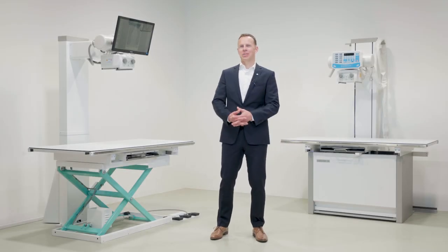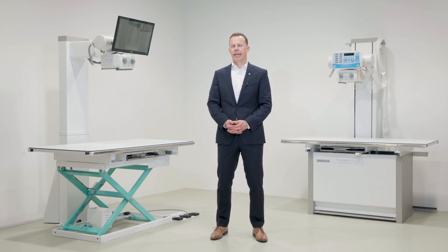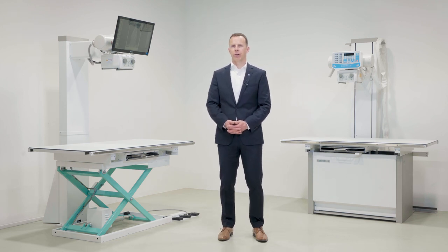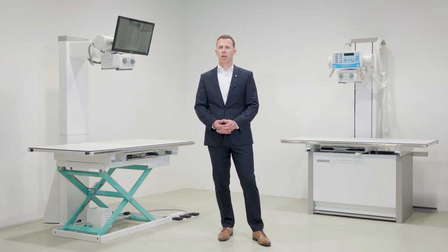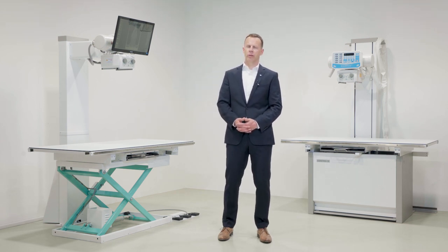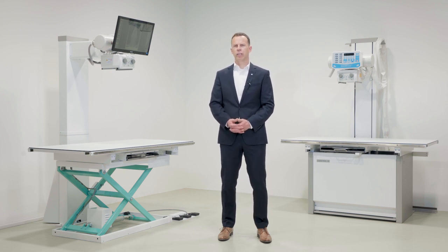Of course, all our systems are available with full power 32 to 50 kilowatt generators, including stored energy generators that can work on household outlets. We also offer monoblock solutions. A selection of top DR panels and corresponding acquisition software contribute to crystal clear images.